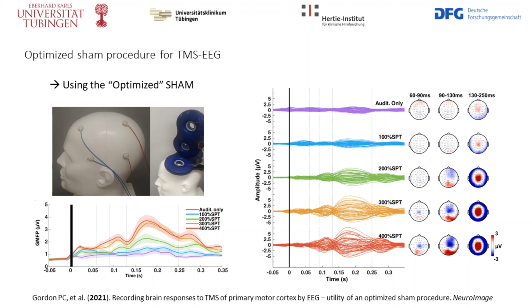So in our design, where we apply this electrical stimulation with electrodes on the scalp, using this particular setup, we figured that if we reach electrical stimulation intensities of above 3 times that of the individual sensory threshold, then there will be little increment in the EEG response amplitude.